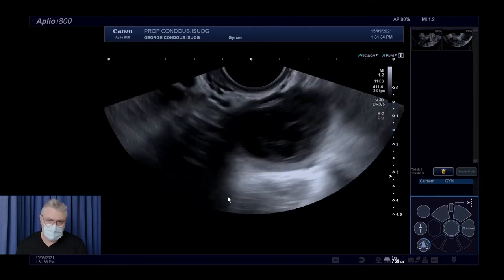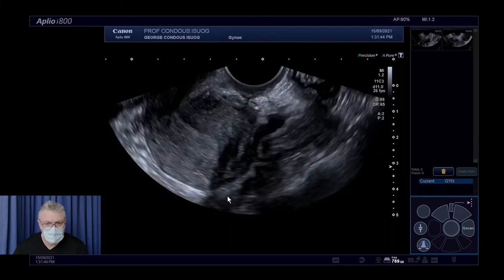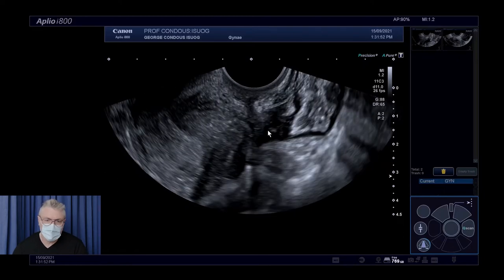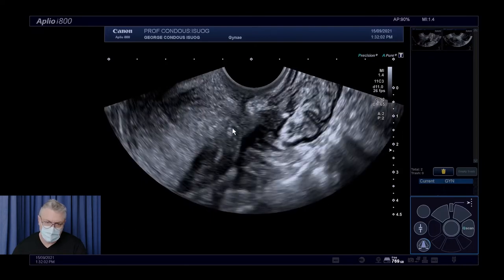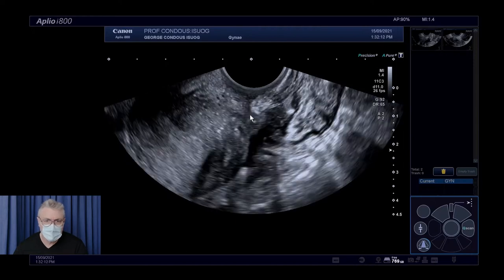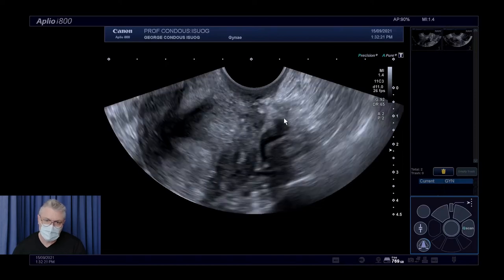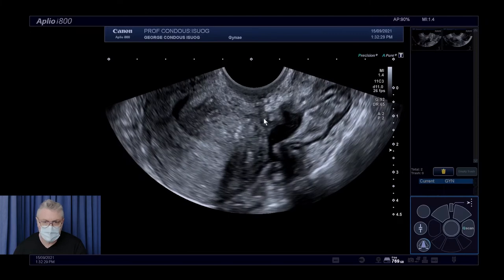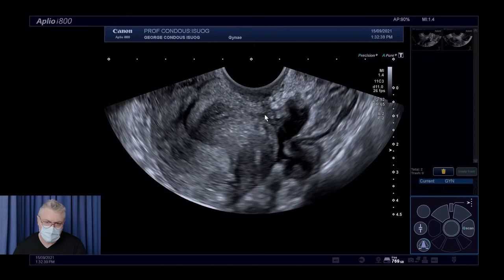Looking at the rectal lesion in the context of the bowel: here's the bowel, here's the uterus, and here is the rectal lesion. As I gently press on the probe to elicit the sliding sign, we can see that the bowel is completely fixed to the posterior uterine fundus. It's also fixed in the region of the torus uterinus — there's probably an endometriotic lesion just there. We've got a probable antiverted retroflex uterus being drawn back posteriorly towards the posterior compartment disease, which is primarily in the anterior rectum and in the torus uterinus. I'm satisfied with the degree of this unifocal rectal lesion, measured in three planes, fixed to the posterior uterine fundus and torus uterinus.